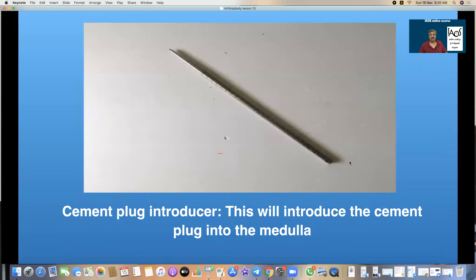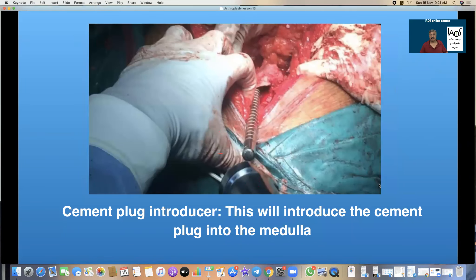That is a cement plug introducer. This is used to introduce the cement restrictor into the medulla, pushing it in as far back posteriorly as possible to the entry point.